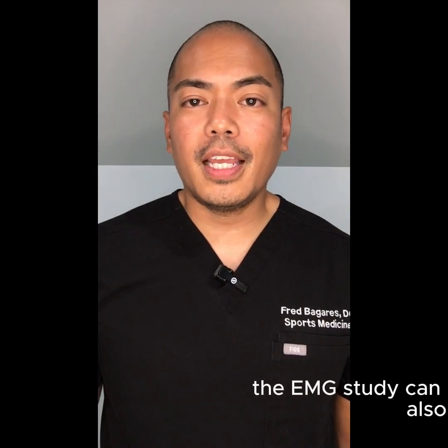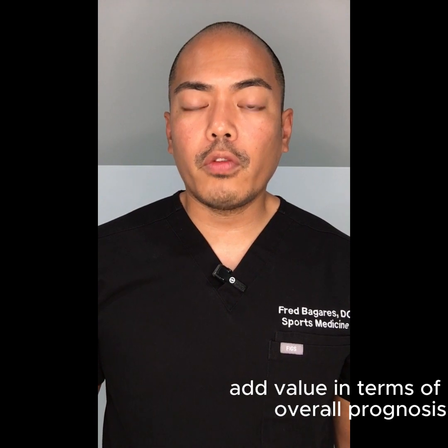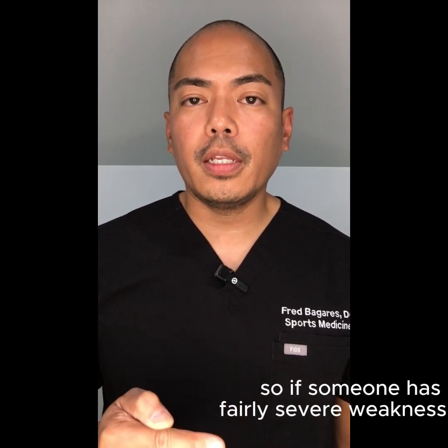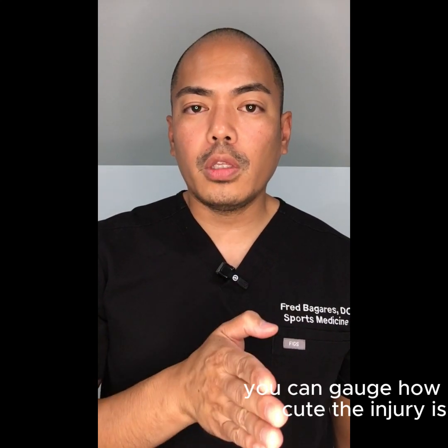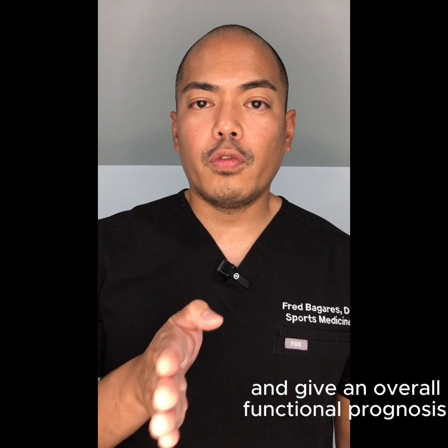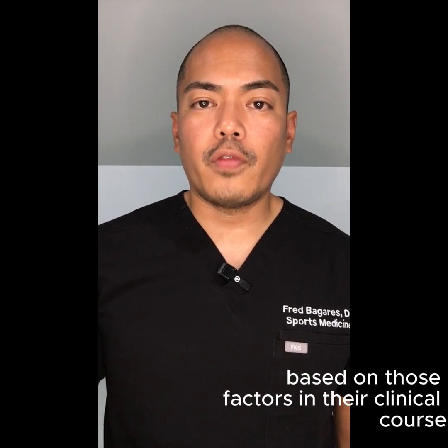The EMG study can also add value in terms of overall prognosis. So if someone has fairly severe weakness, you can gauge how acute the injury is, if there's any evidence of reinnervation, and give an overall functional prognosis based on those factors and their clinical course.